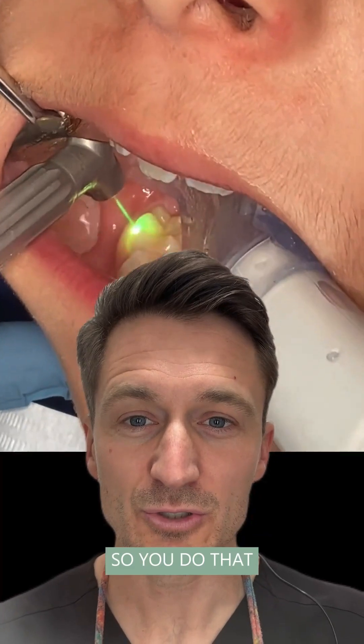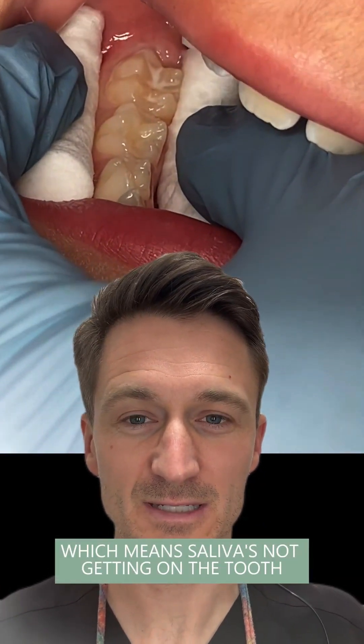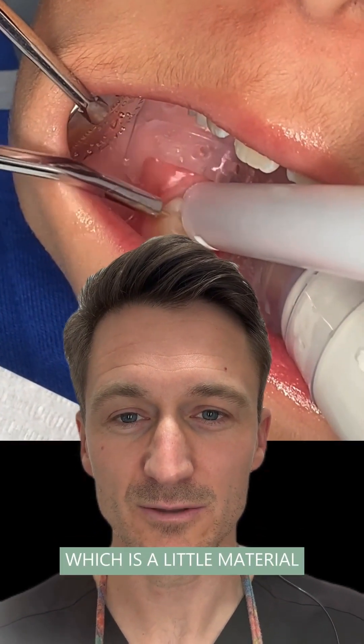So you do that, and then you actually keep the tooth clean. You use proper isolation, which means saliva is not getting on the tooth and bacteria floating around the mouth isn't getting on the tooth. And you protect the tooth with something called a sealant, which is a little material that goes onto the tooth.